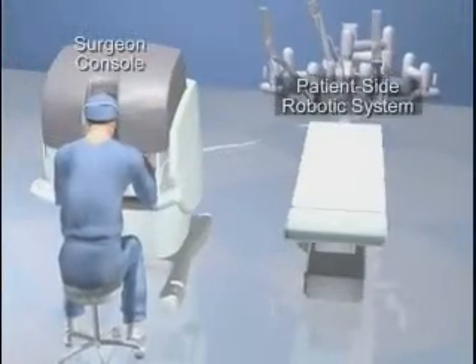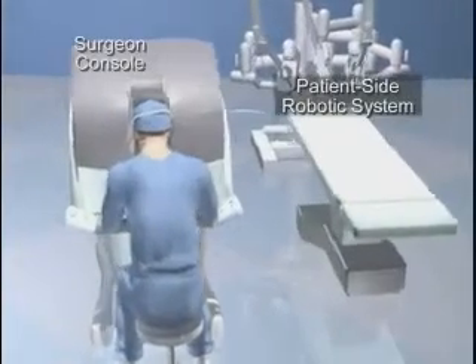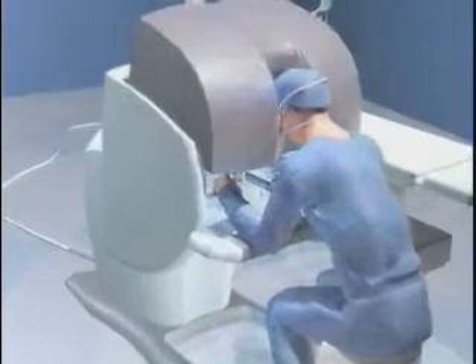The DaVinci Surgical System is a state-of-the-art medical device comprised of a surgeon console and a patient-side robotic system with a high-resolution camera and micro instruments used in surgery.